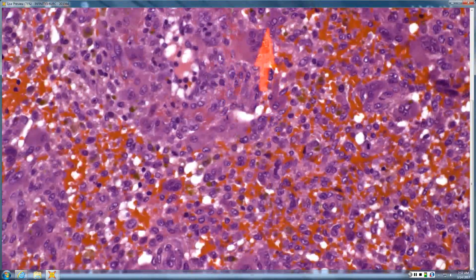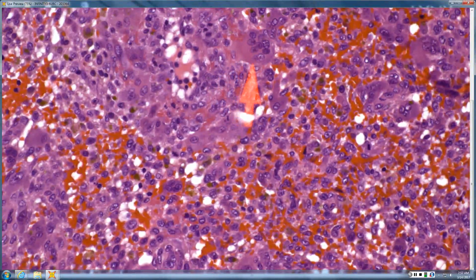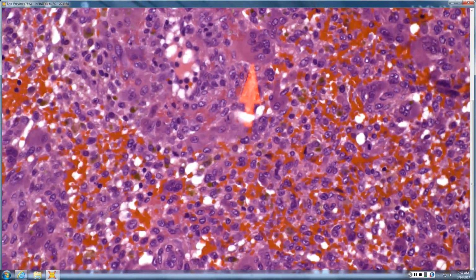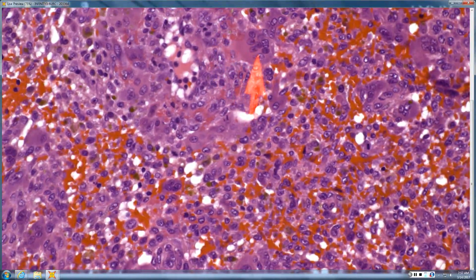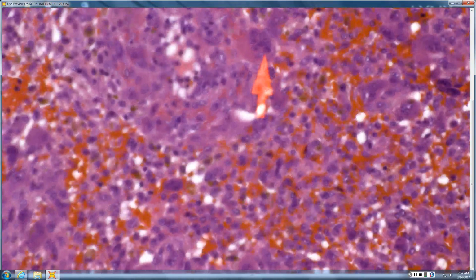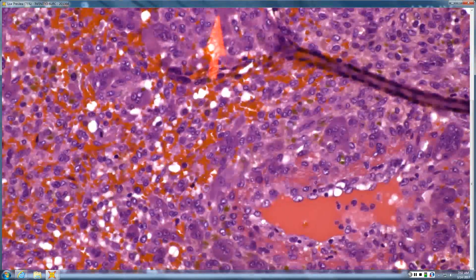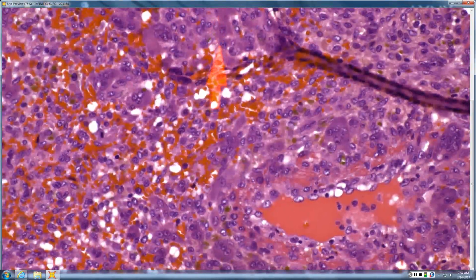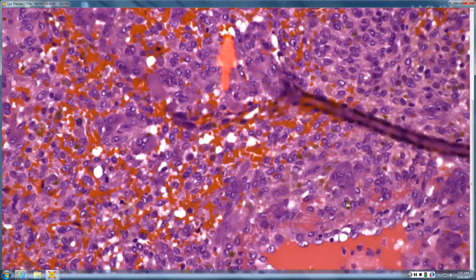So tell me, what do you see here? Is that a multinucleated cell? It is a multinucleated giant cell. Is that typical in epithelioid sarcomas? No, not so much, right? And what kind of giant cell? Are they all at the periphery, or randomly distributed? That's like an osteoclast. So they're randomly distributed. They have a pretty dark pink cytoplasm, and they are glomming up to adjacent cells and molding to them. So you're absolutely right, that looks like an osteoclast. So it's an osteoclast-like giant cell.